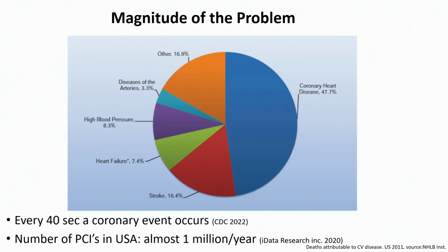The highest risk period for these patients is within the first year of stent placement. And a large percentage of patients, almost 20%, will present to us in the operating room in this high-risk period, and it falls upon us to get them safely through this time.